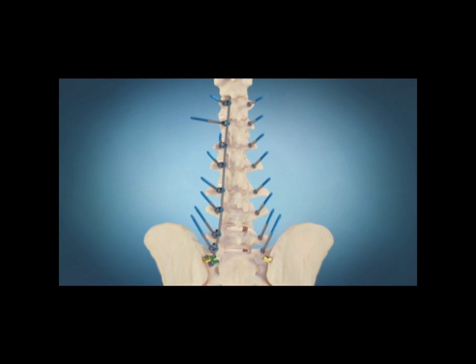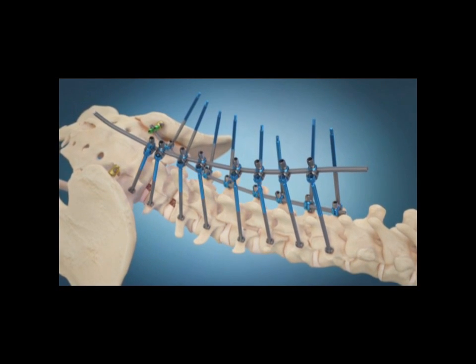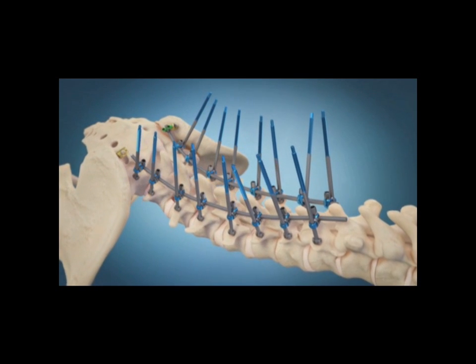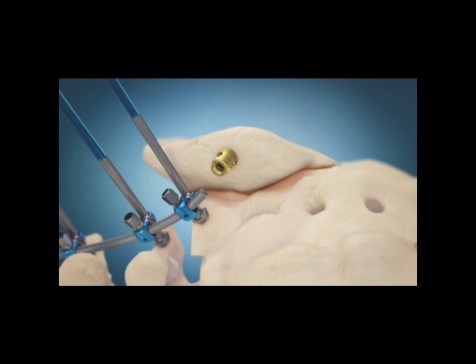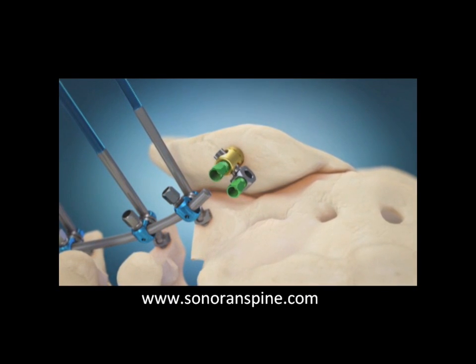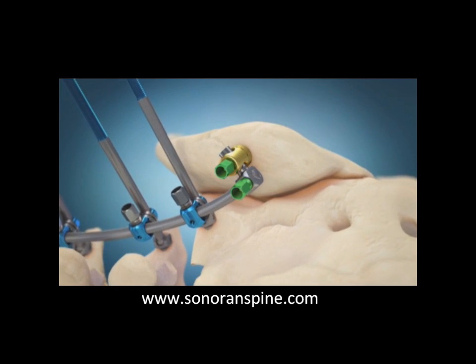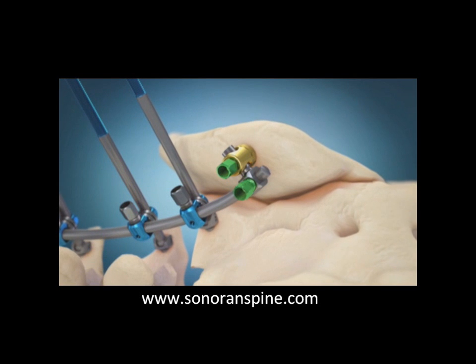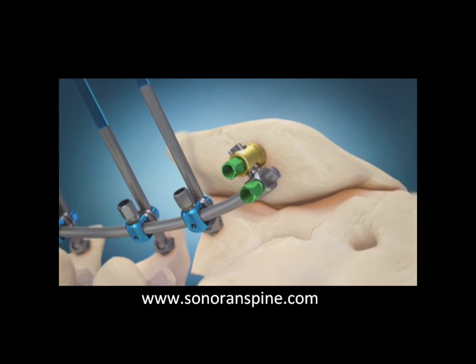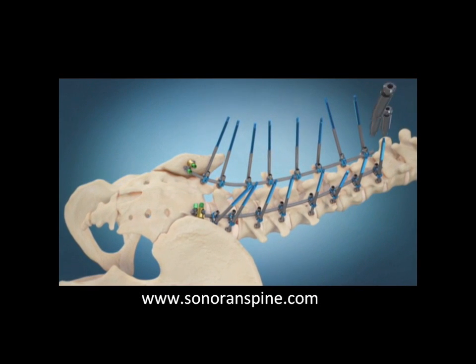The second rod is actually a second chance to get additional correction. So that rod also is bent to the desired contour. It can be placed in an iliac screw, the same as the first rod was. This gives more strength to the lowest part of the instrumentation. Once that lowest part is connected and in place, the S1 connector is locked tight, and then the same thing happens again.